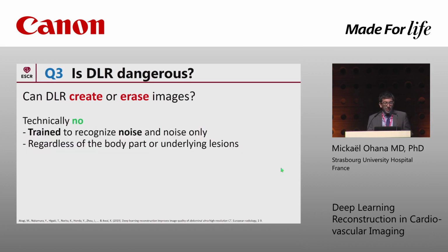So the question is, can this algorithm create or erase some lesions or some images? Well, technically the answer is no, because as we saw earlier, the algorithm is only trained to recognize noise, and noise only, whatever the body part or whatever the underlying lesions. So it will just remove noise.